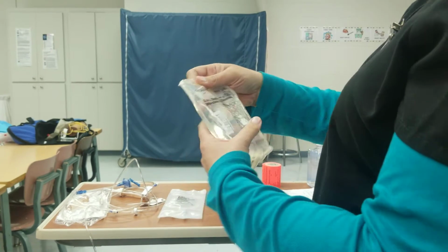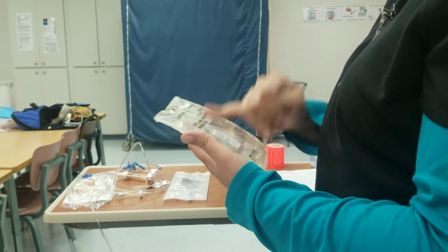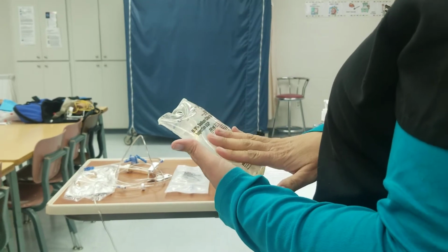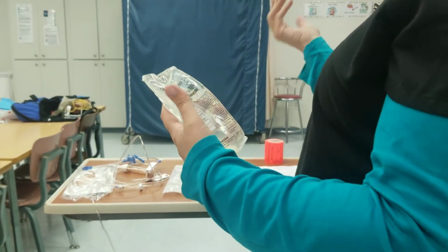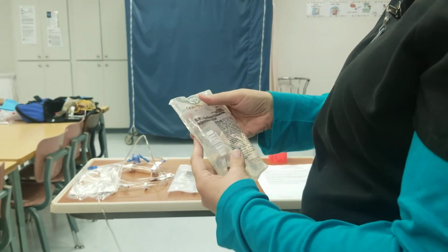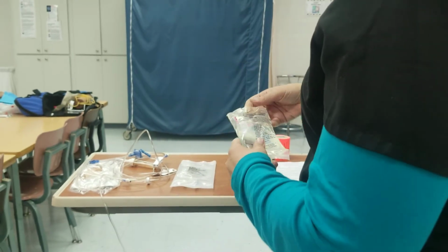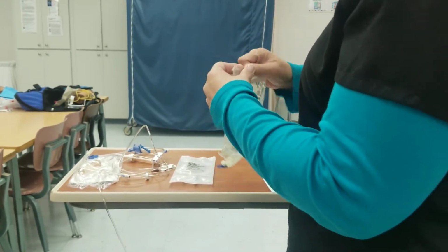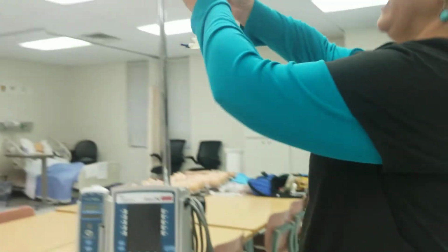And looking for clarity, making sure that we've checked this against our MAR, that we've got the right kind of fluids in the bag. Because you got normal saline, you got dextrose, you've got half normal saline, all that. So this one's sodium chloride, 0.9%, so that's what we're looking for. It has a little loop here, so we're going to go ahead and hang this up.